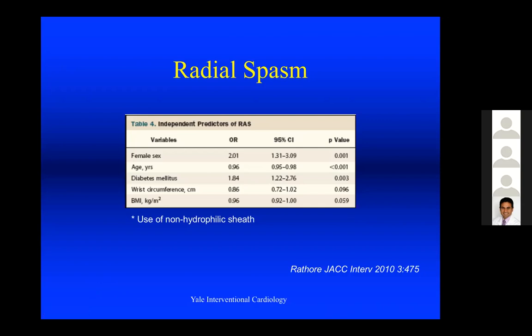Radial artery spasm is very painful. It makes it very difficult to maneuver the catheter. There is some resistance where the patient won't complain at all, and that's usually related to tortuosity or disease.